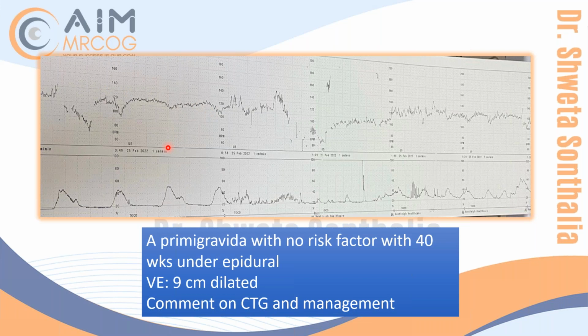Variability is normal. Yes, very good. What else? Very normal. Acceleration, any acceleration you can see? Yeah, there are accelerations.